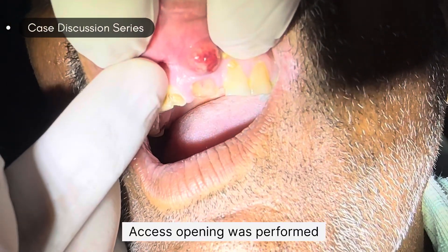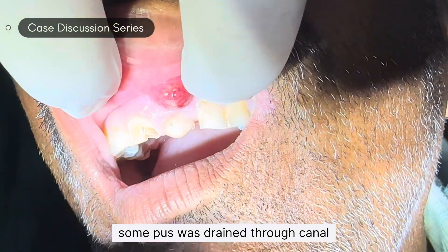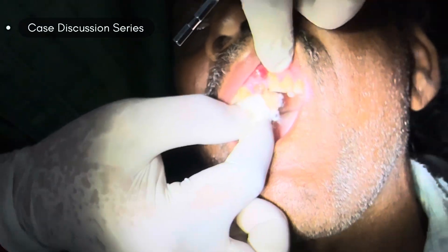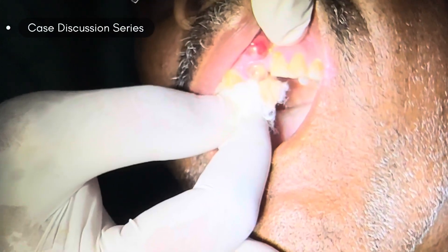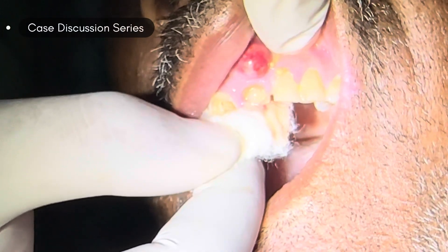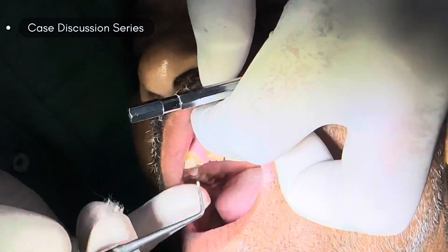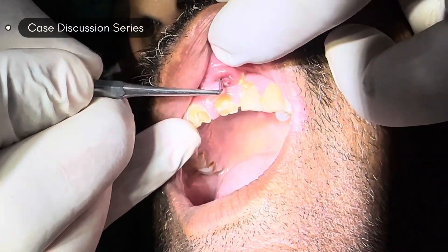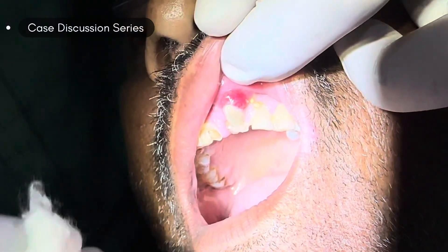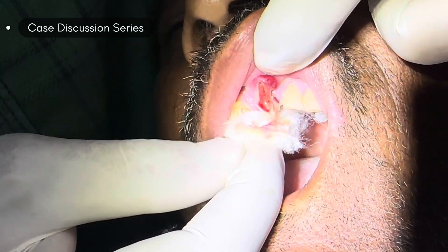BMP was performed and some drainage was established through the canal. You can see that by giving some pressure over the periapical tissue areas, we drained some pus through the canal. The remaining pus was drained by giving a prick over the most prominent area of the swelling, and the pus started to ooze out as soon as we incised the swelling.